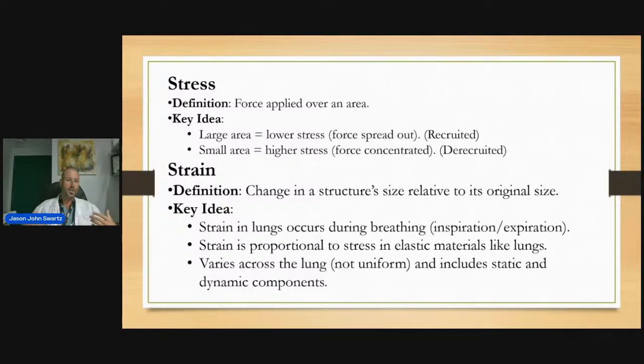So, they're directly proportional. But just to complicate things, again, repeating myself now, sorry, you have the de-recruited areas of your FRC not doing their jobs, not taking part. Maybe they're snapping open and closed, which causes a whole other issue related to lung injury.